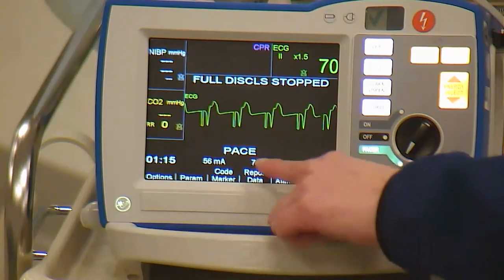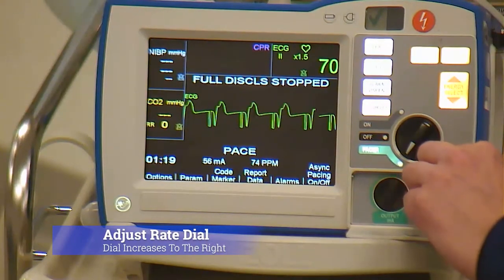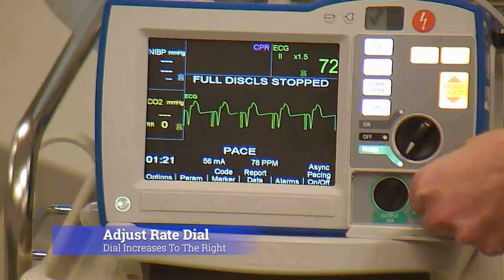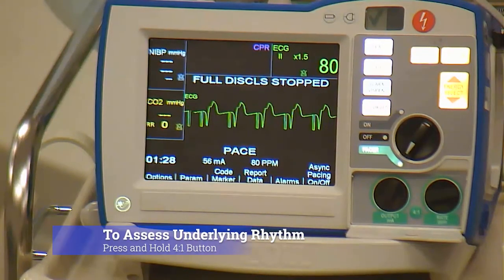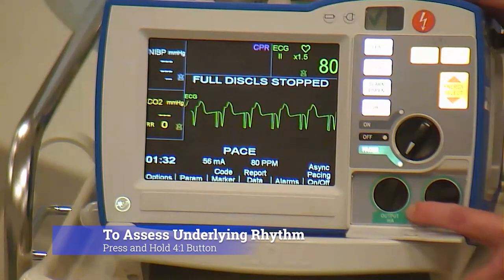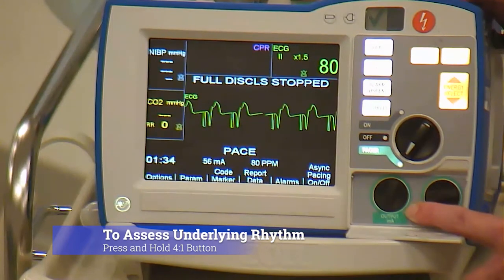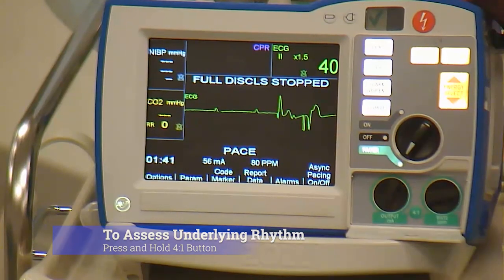If the provider would like a different rate than 70, then you'll turn your dial to the right rate until you increase it. Once the patient is paced, if you would like to assess the underlying rhythm, hit this 4 to 1 button and it will only deliver a pacer spike every 4th beat.